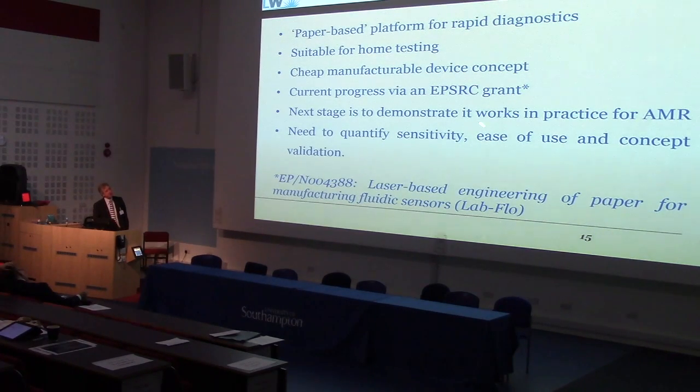We think we need to demonstrate it works now in practice for AMR, so we need the help of medics, and you quantify sensitivity, but with a range of wells here, you've got 100 or 1,000, you can have various degrees of sensitivity in the X and Y directions. So we need to validate the concept for future AMR work. That's it.